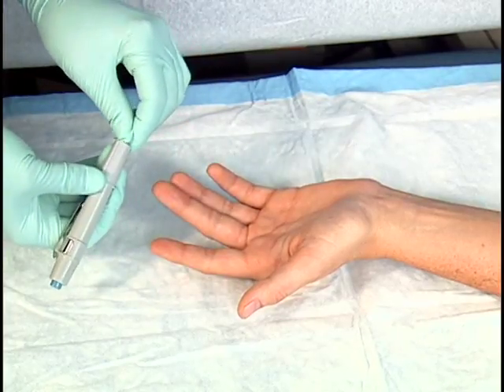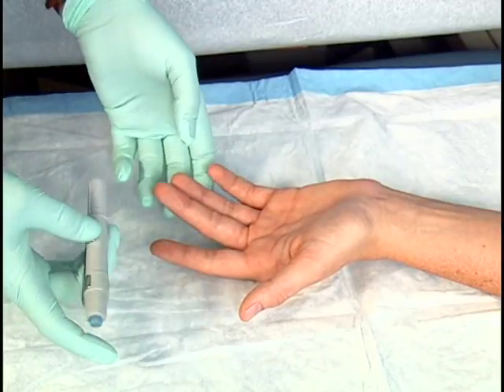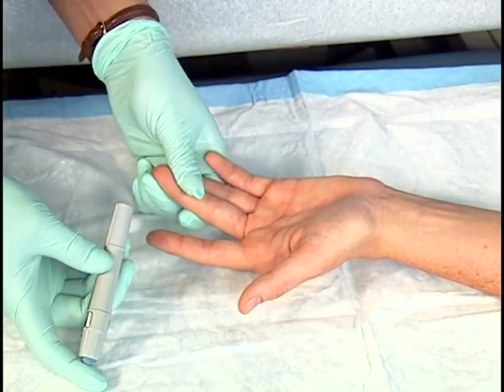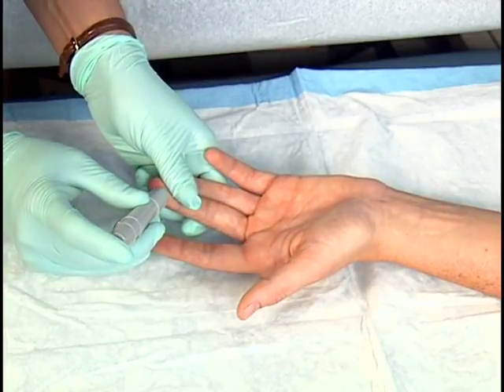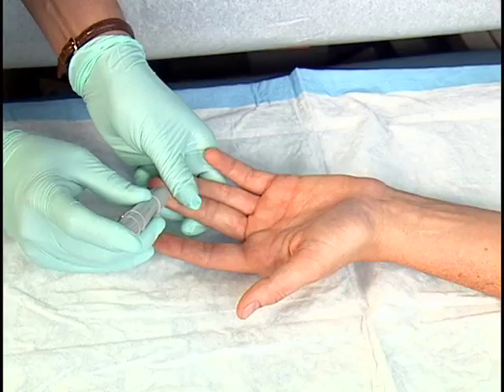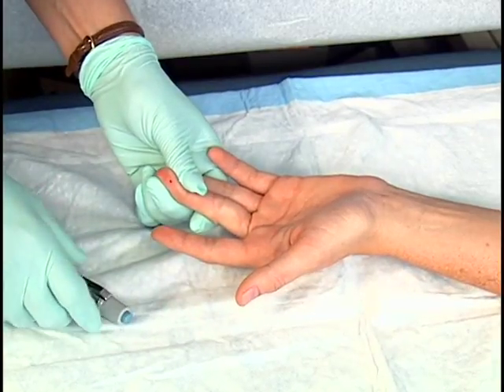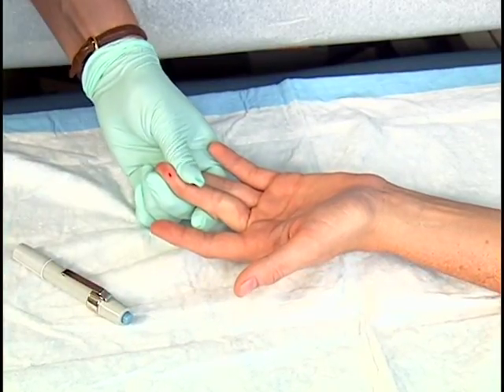Using a twisting motion, remove the plastic post from the end cap. Grasp the patient's finger and position the Lancet. Firmly depress the activation button without moving the device or finger until an audible click is heard. Pressing the activation button causes the Lancet to puncture the skin and then retract into the end cap. Wipe away the first drop of blood and use the second drop for the test.